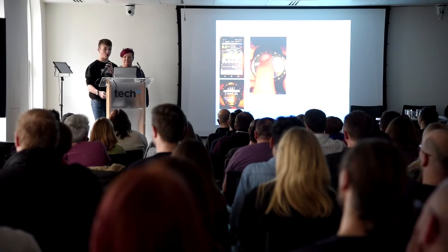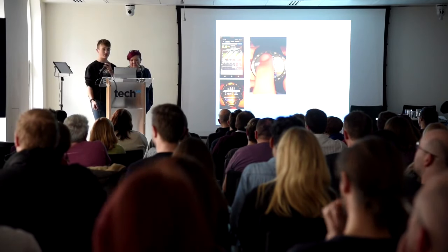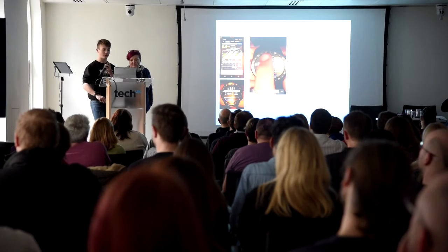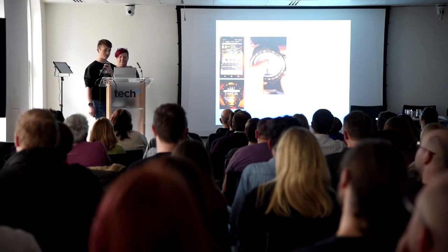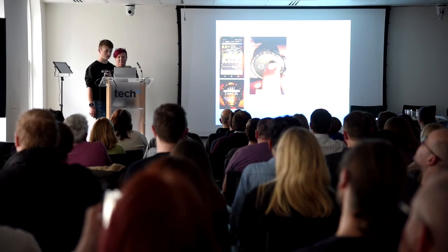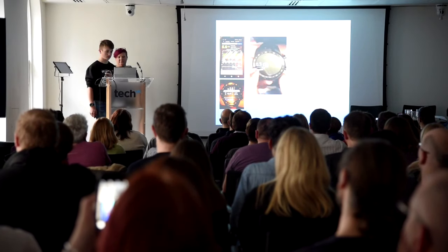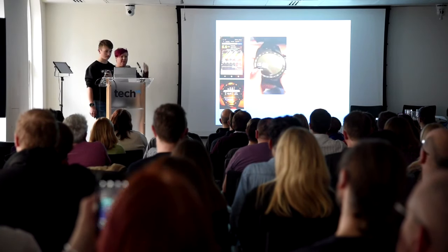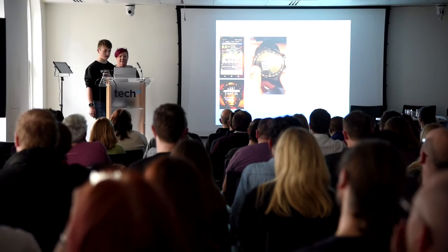My watch is probably my favourite bit of technology, with just a quick flick of the wrist. This is me bolusing from my watch. That's Spike in the background, just in case you heard the 5.6 flat there. That's Spike talking his numbers.